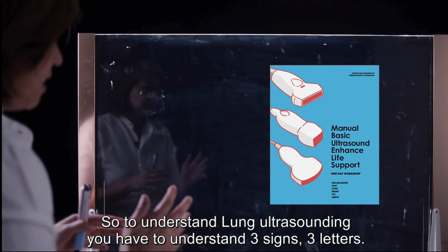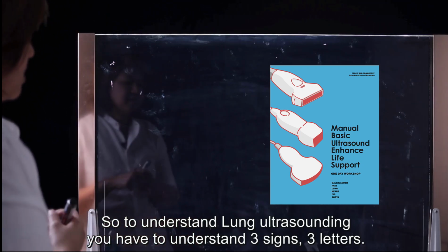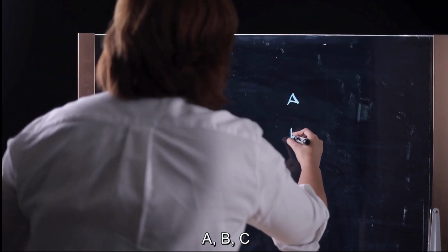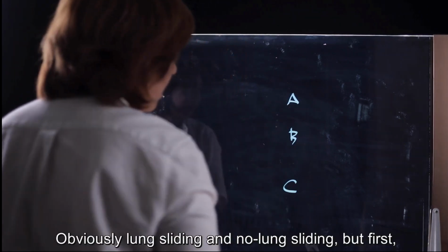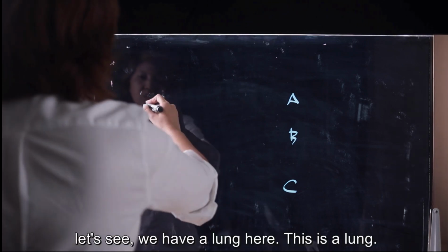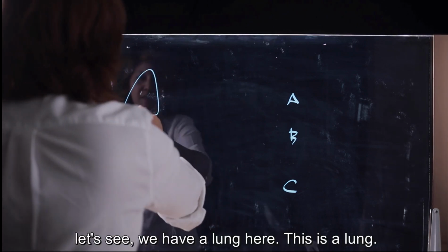So to understand lung ultrasound, you need to understand three letters: A, B, C. And obviously lung sliding and no lung sliding. But first, let's see if we have a lung here. This is lung.